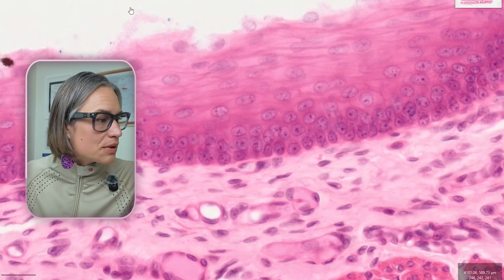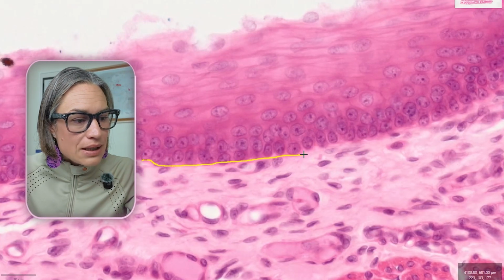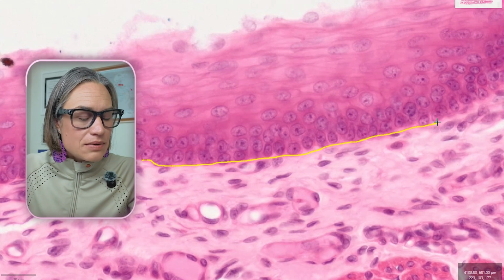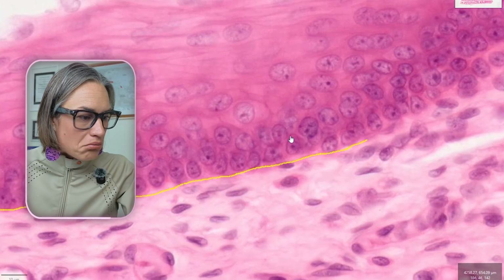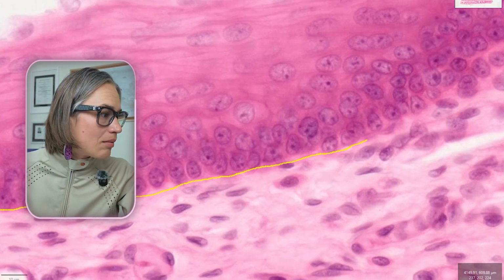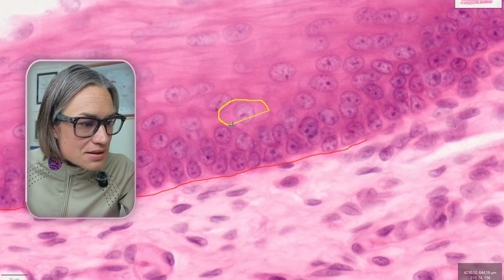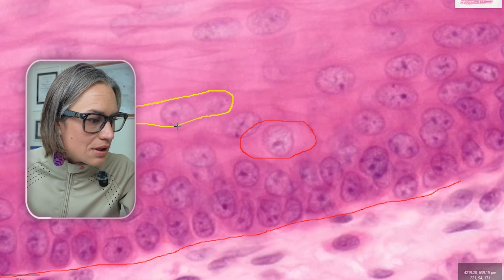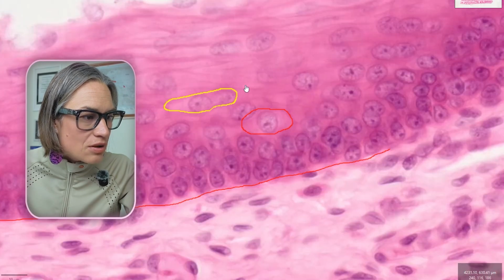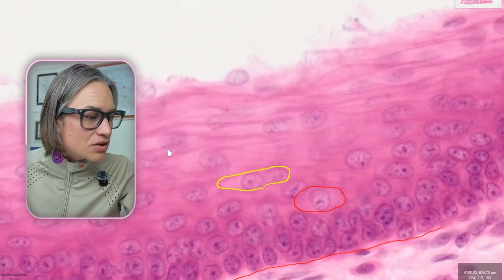And as we see, multiple layers of surface. And this is beautiful because look, here would be our basal membrane that, again, we would need to stain with a specific stain to actually see it, but look how beautiful. These are all roundish. Oh, my friends, look at this. Look how they flatten this cell here. You can see its beautiful outlines. Look at this. I probably drew over a nucleus of another cell, but oh my goodness, you can see so nicely that they get flat towards the surface.